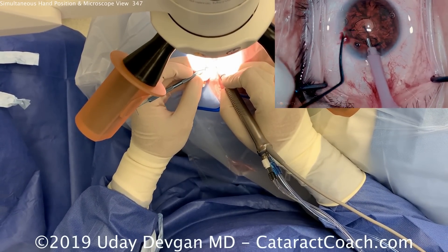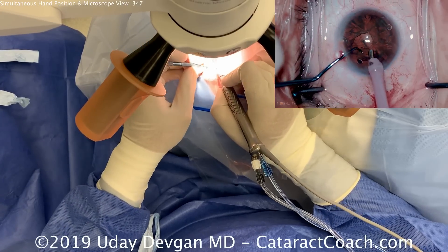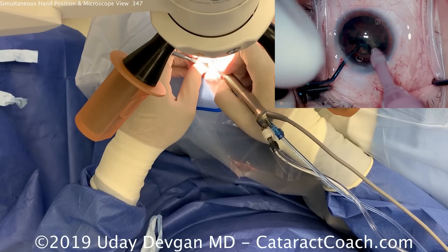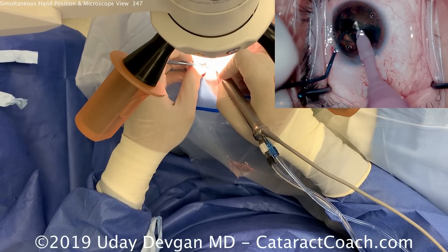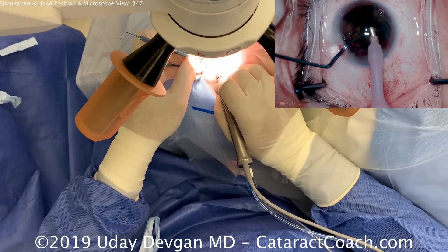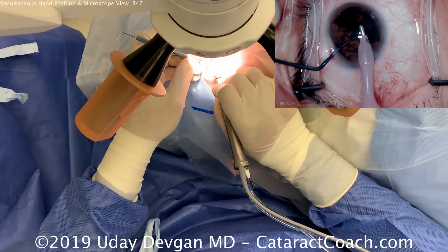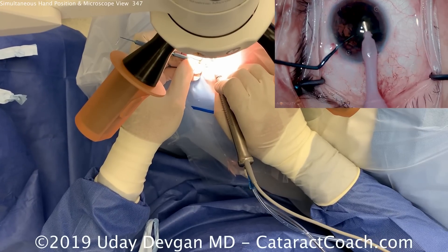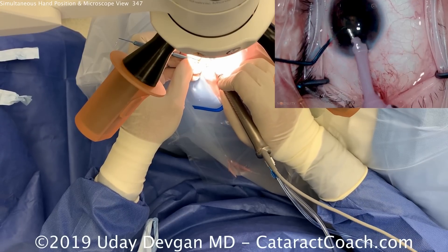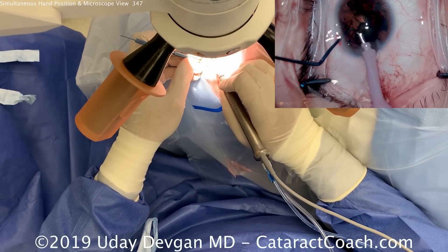Washing off some of the blood from the surface of the eye. Chopper going in the eye, and we're going to buzz in the phaco probe to the sub-incisional area. A vertical chop gives us two halves. Now the first half can be brought up out of the capsular bag and emulsified. This is not too dense of a cataract, so we're able to have just one chop at the beginning to give us two halves.